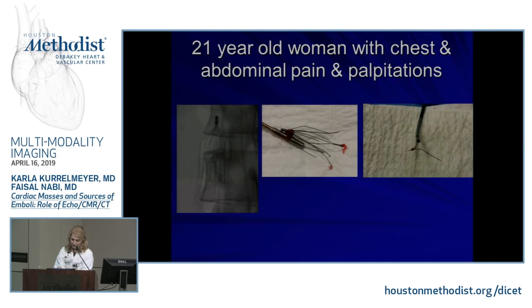So this is one of the barb retrievable filters. The company actually helped because this filter has been fractured a lot, and there are a lot of lawsuits. So they sent their expert to come down and help us remove it. You can see this is what it looked like on fluoro. They removed the fractured filter.